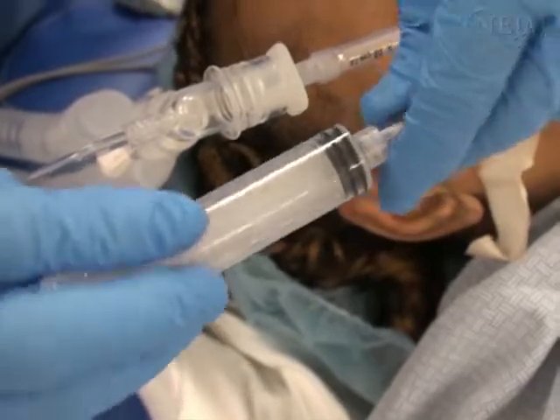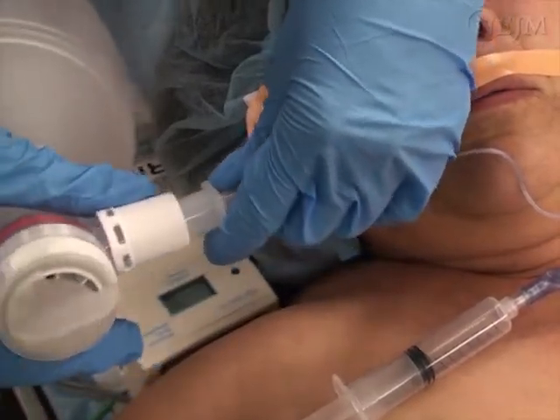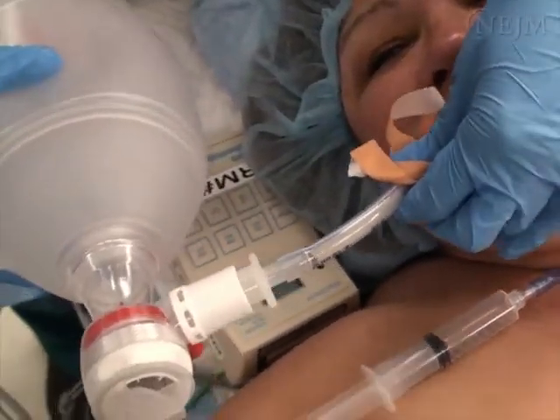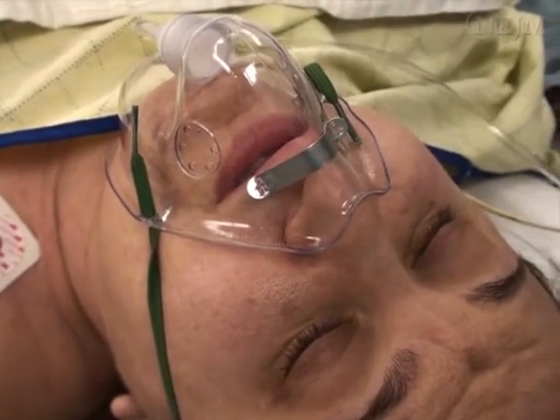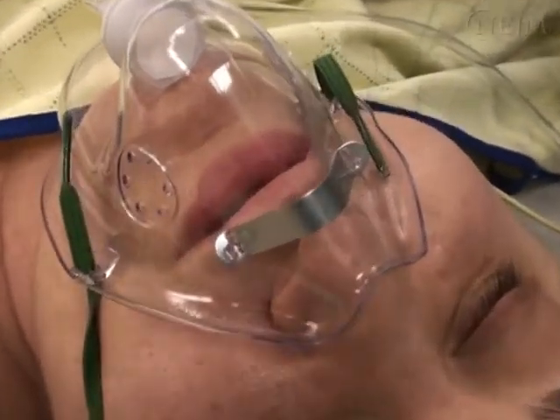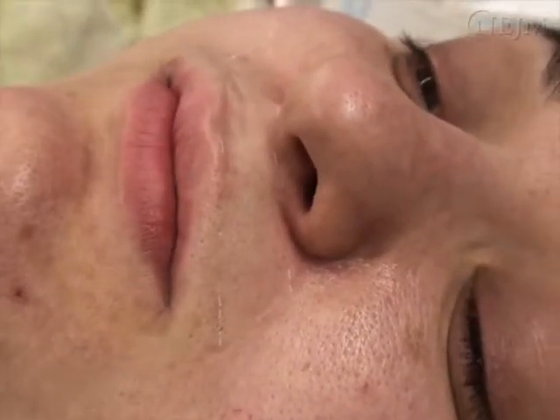When the patient is ready for extubation, attach a syringe to the pilot balloon and completely deflate the cuff of the endotracheal tube. Positive pressure ventilation with oxygen can be provided with a bag valve device during endotracheal extubation to maximize alveolar recruitment. After extubation, immediately verify that the airway is patent and that adequate spontaneous ventilation is occurring. Observe the face mask for the rhythmic condensation of exhaled breath. Phonation and speech after extubation are reassuring signs that vocal cord injury and acute glottic edema have largely been prevented.